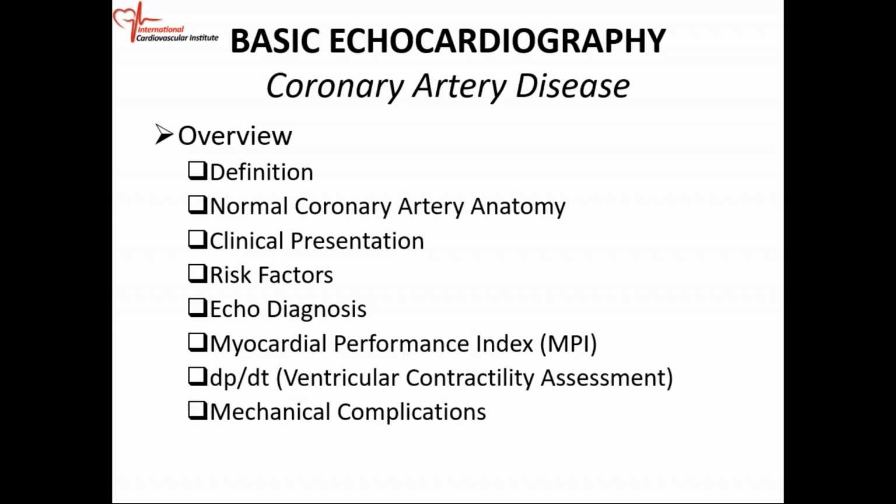We're going to discuss the clinical presentation, how those patients present to their doctor, the emergency room, or wherever. Look at risk factors for coronary artery disease and how you can use echo to help you not only diagnose but to follow these patients. Echo is crucial in making the assessment of coronary artery disease and following these patients, because if you have someone with coronary artery disease and the ejection fraction is falling, then you have to institute certain measures to change that.